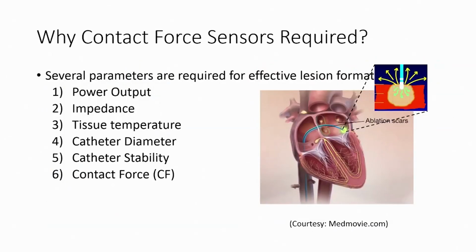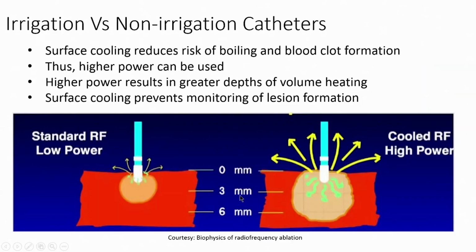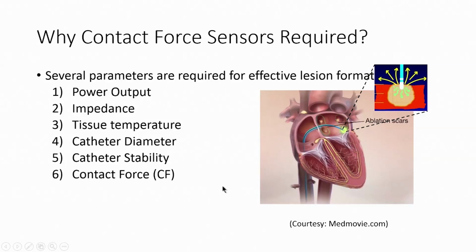Now, why is it required? Because to get effective lesion formation and to get an idea of the amount of force that we are applying, and where we are applying it during the surgery. So, you see here, this is the ablation scar, and this ablation scar depends on several parameters, like we discussed earlier.